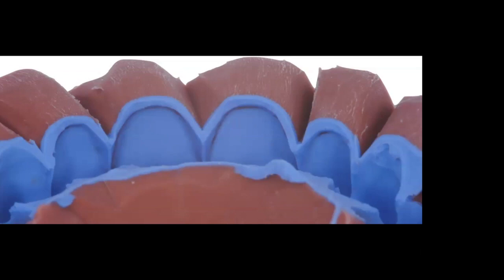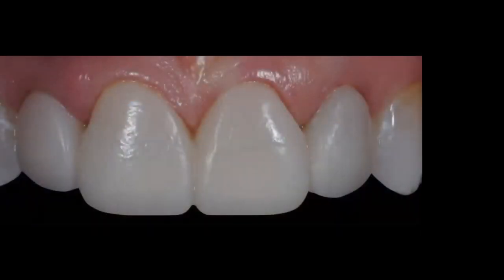Those vents are very important. I also follow all the roundness of the gingival contours to ensure easy access to any excess. The result immediately after delivery looks exactly like the prototype — it came directly from the wax-up. For the clinical steps: spot-etch, apply a thin layer of adhesive on the etched spot, light-cure for 10 to 15 seconds, inject bisacryl into the internal surface of the putty matrix, and seat in the patient's mouth.